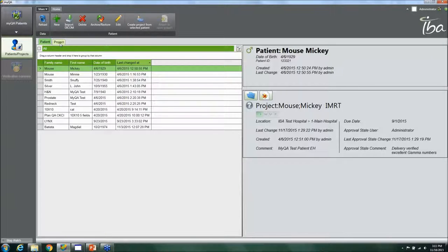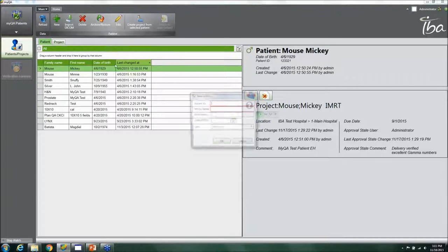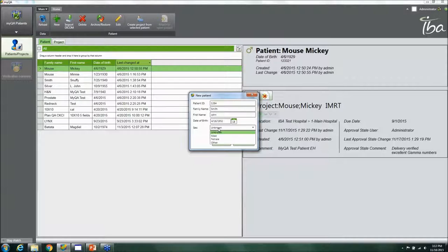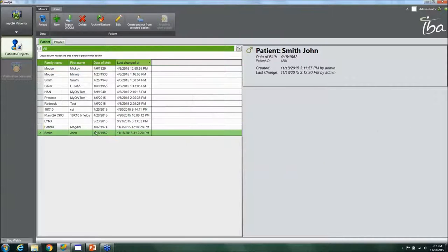To quickly create a patient, you can import a DICOM or just click New Patient. Clicking New Patient lets you enter a patient ID number, name — for example, Smith, John — date of birth such as April 18, 1952, and then assign a gender.